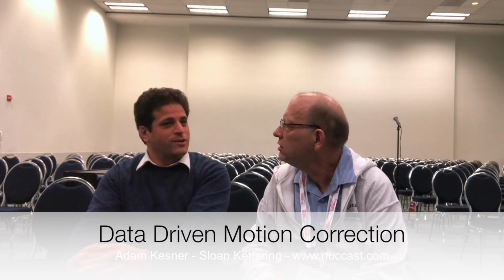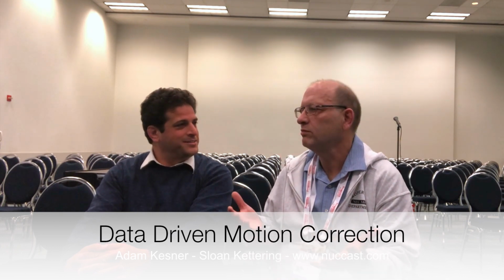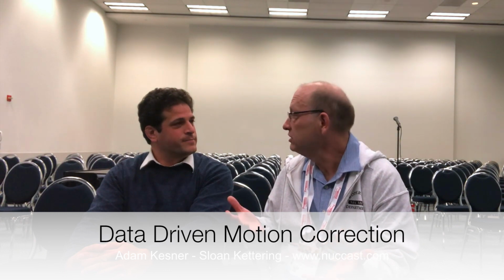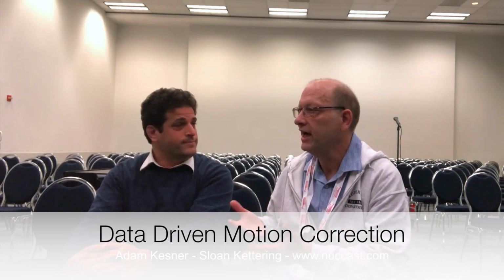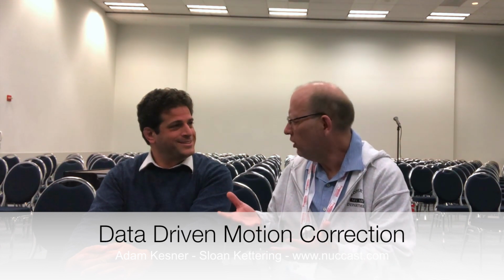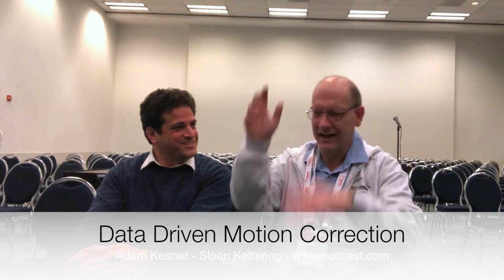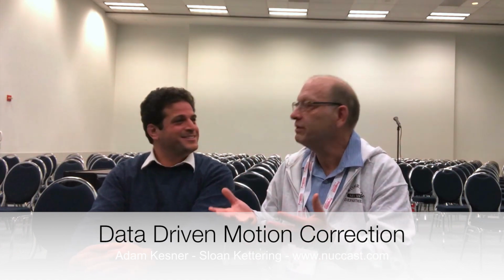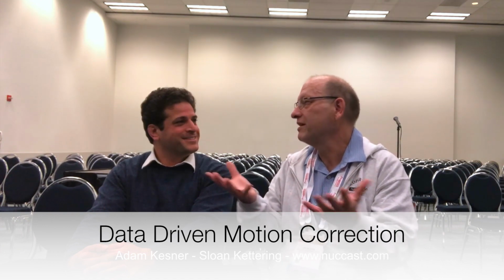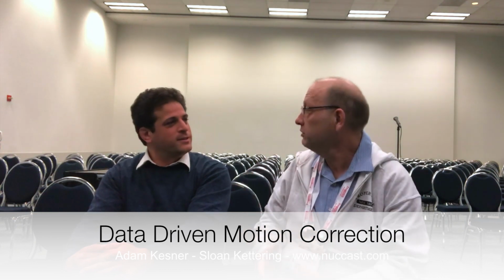I suppose I could frame the challenge for the field. Yeah, sure. I mean, part of the problem is that motion degrades our images, and we saw that today when we had an example of a dynamic PET which had 0.9 second frames, and you could see the chest moving in and out. You see the heart moving all over the place. We don't normally see that, but when that's happening, we realise we're going to be blurring the image by the amount that people move, or if people move around, that's going to blur the image. So it's important that we deal with this problem.